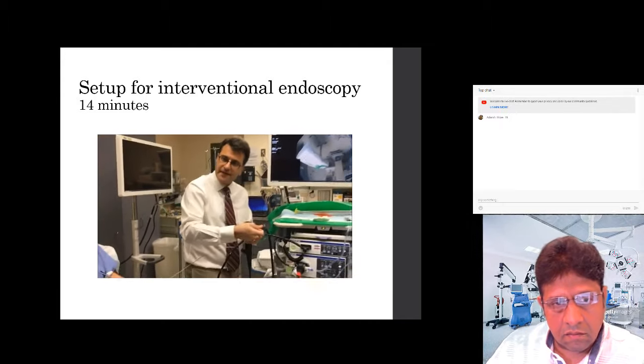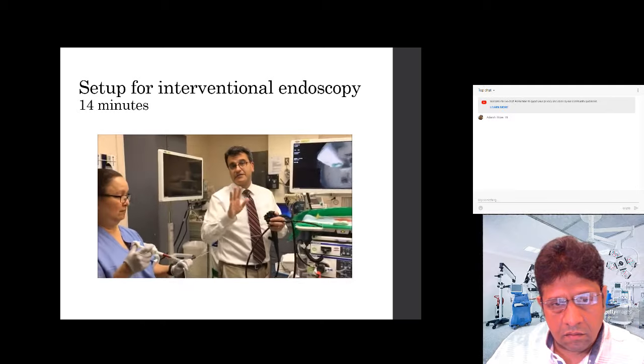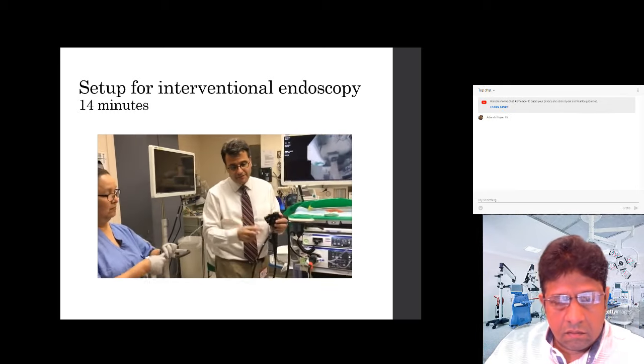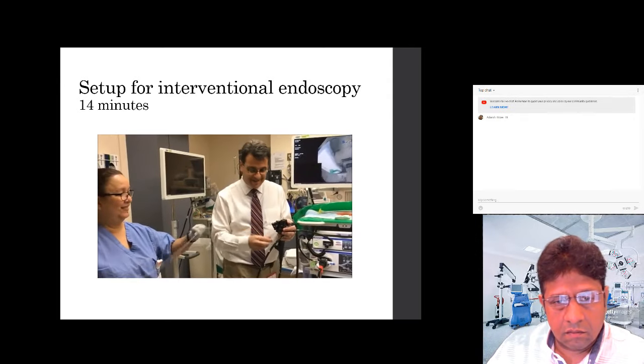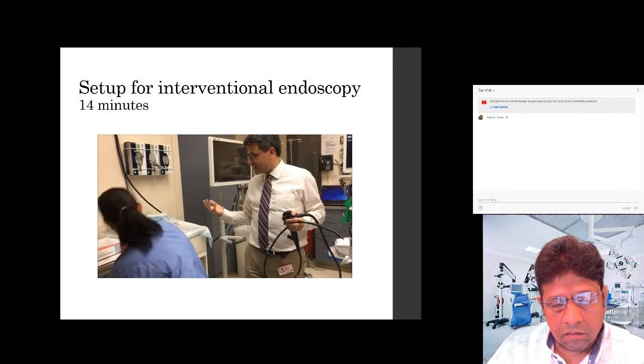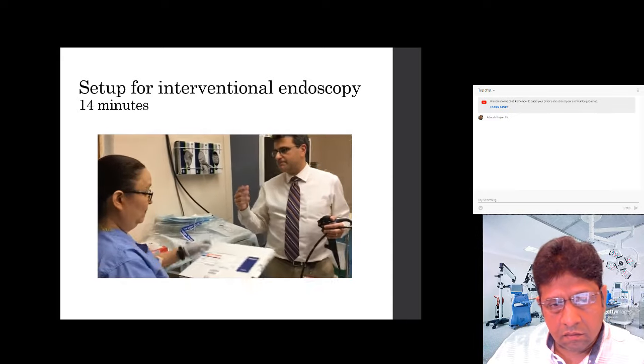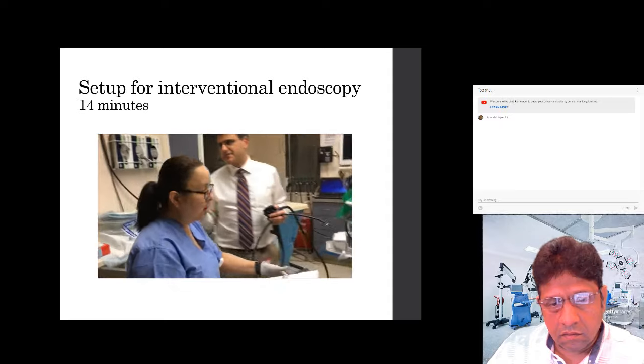So once you push it all the way down, it releases the clip and you're done. If you misfire, you got to get another clip. But that happens. You know, what are we going to do? Expensive, but we try not to do that. Down to two things. We have the bicap. And then I'll do the banding at the end because that's usually the toughest.